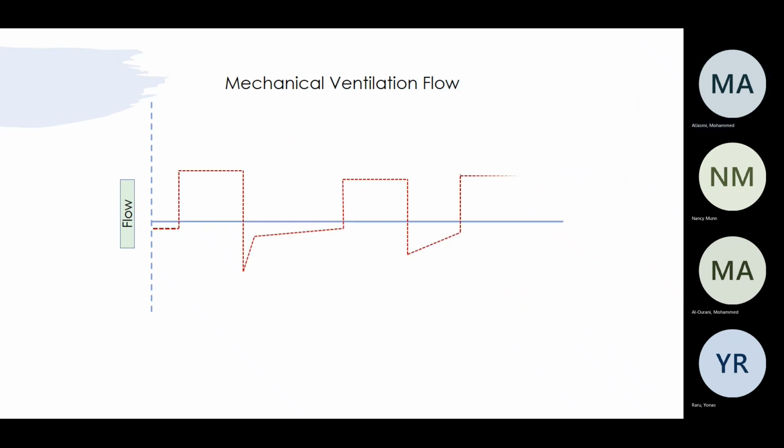All right. Wow, there's something different in here. You still have auto PEEP, but there's something else, is that right? Within the expiration, there's a steep drop and then a kind of leveling off. Good. What does that tell you? Let's think about it loudly.